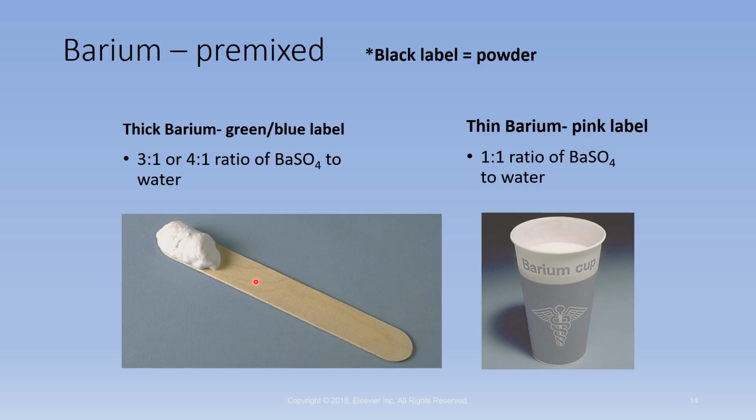If you look on 473 in figure 12.49, there is a tube of Veribar pudding, and notice it says barium sulfate oral paste. So this is what it would look like. It almost looks like marshmallow cream. That's about the consistency of it, like marshmallow cream. And they use this during esophagograms. They can really use it in anything they want, but it's a lot of times used in esophagograms or in what we call video swallows.